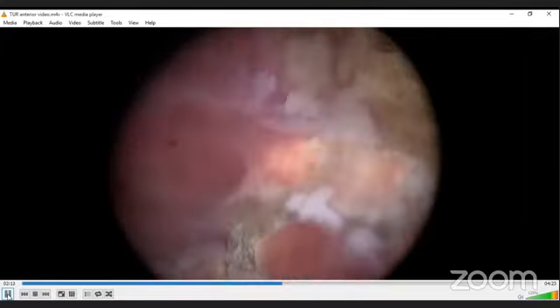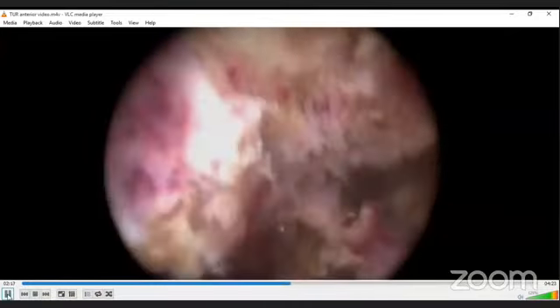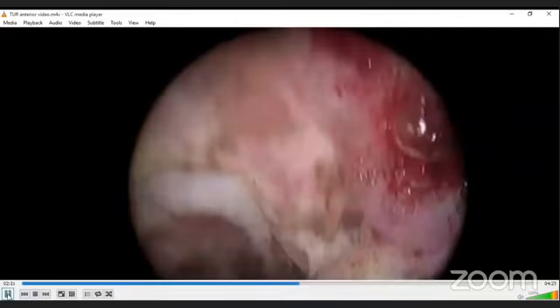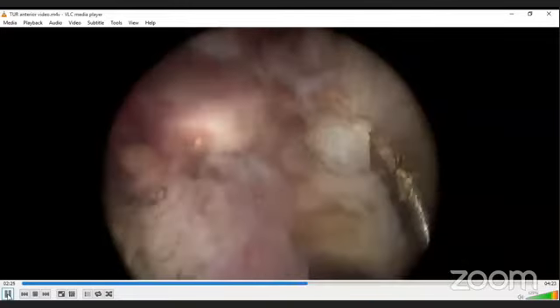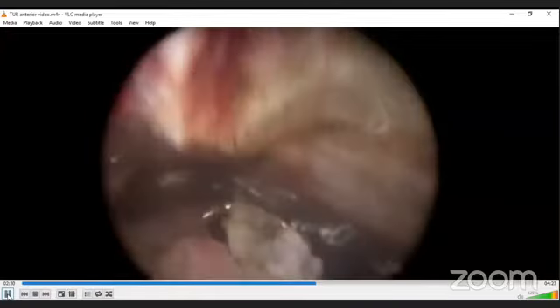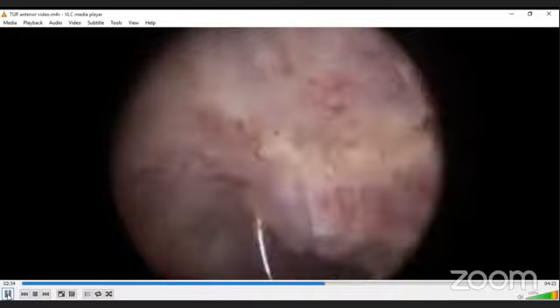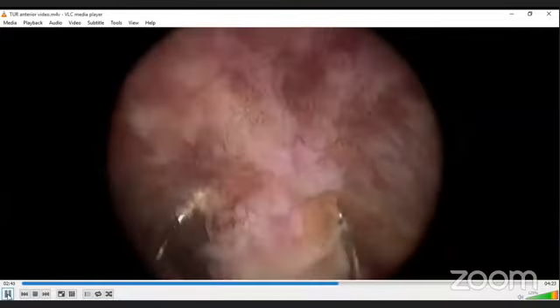One important thing in an anterior wall practically is that the cuts also need to be timed with the bladder movement. So why I say that, in general anesthesia, the movement of the abdomen is uniform and controlled. And as you are going to cut the anterior wall, things are going to move. In spinal anesthesia, it seems it is slightly more difficult. The patient can breathe differently at times, and sometimes they can cough too. Hence, we need to take care when we are doing an anterior wall under spinal anesthesia.